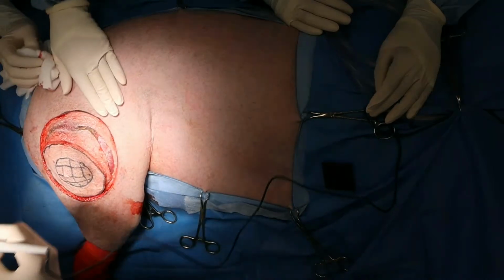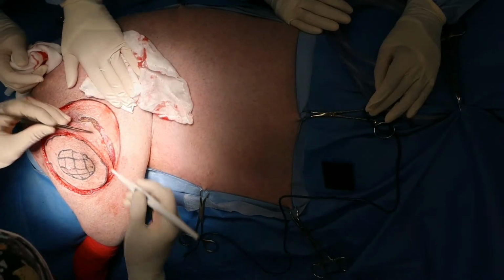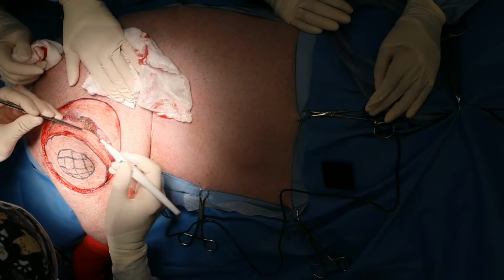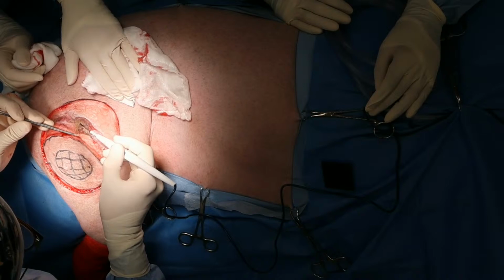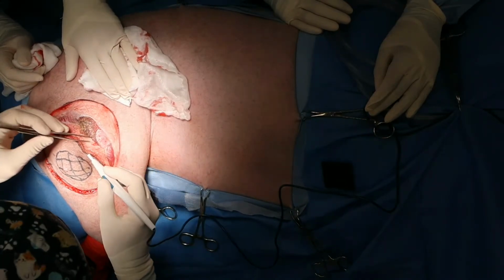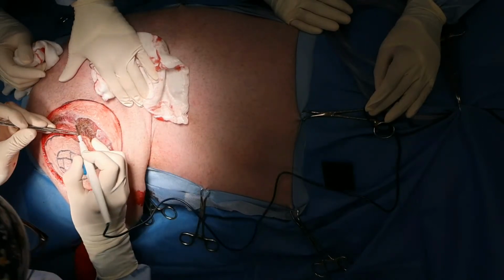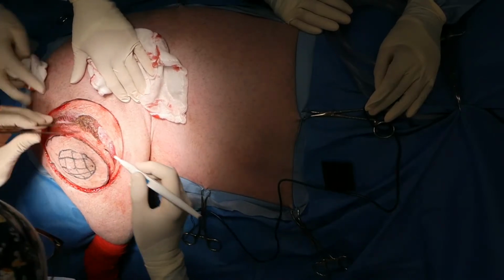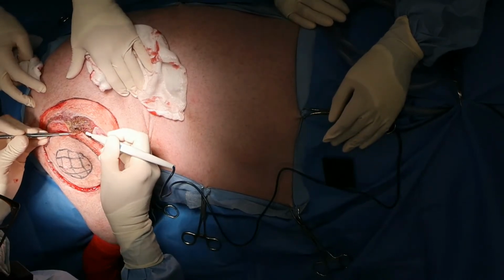You want me to put tension here for you? Yes, please. All right, so you can see here that I'm trying to peel that fascia off the biceps muscle. And you're just using the coag on that? Yeah, I always use coag rather than cut, because cut, you'll see, just cuts too much and it's kind of hard to control, whereas the coag setting is much easier to control.